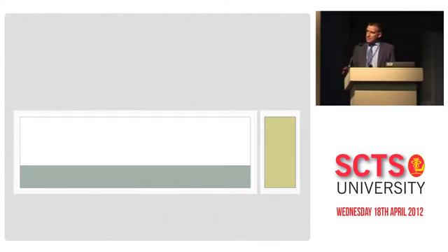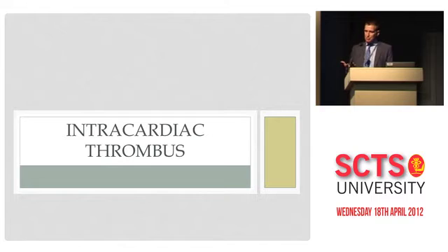So with myxoma, it's very important, first of all, to look at the septum to see where the septal attachments are, and look afterwards at the intra-atrial septum when it's been removed for evidence of any communication. And also it's very important after bypass, particularly with these large myxomas that interact with the valves, to have a look at the valvular function.